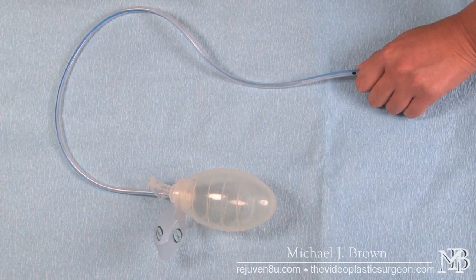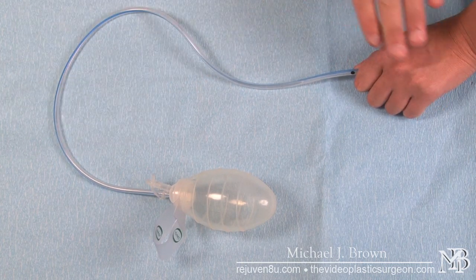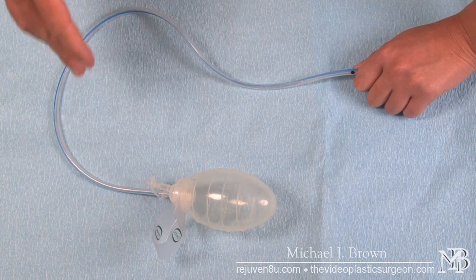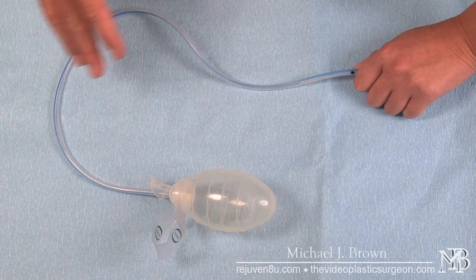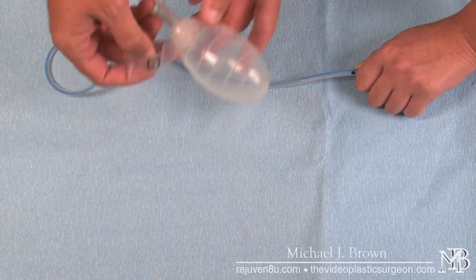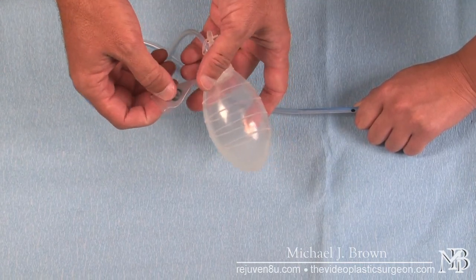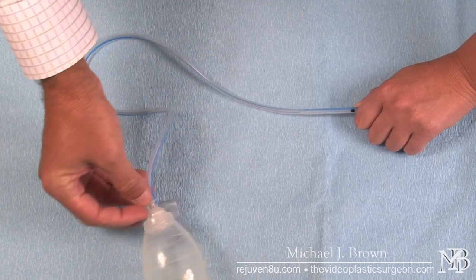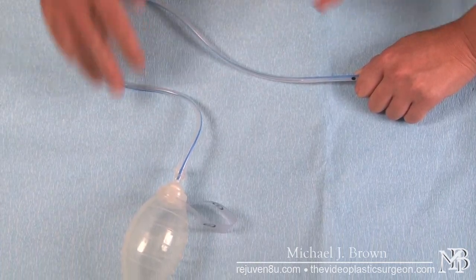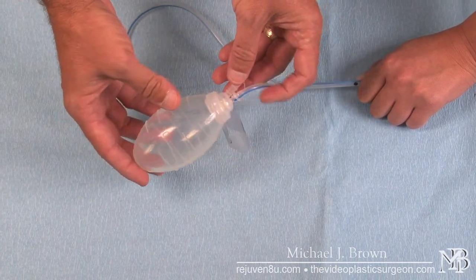If this were the patient's breast, the drain would hang down to about her waist. If it were her abdomen, it would hang down to about her knee. The idea is that there's enough extra tubing so it can be safely and comfortably stored in a pants pocket or pinned to a shirt with a safety pin. So the drain is in the patient, it's been sewn in, and we've already talked about how to empty it and record the values.